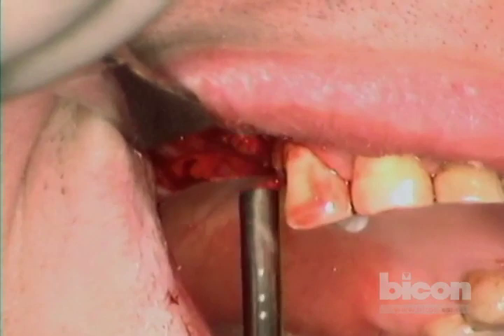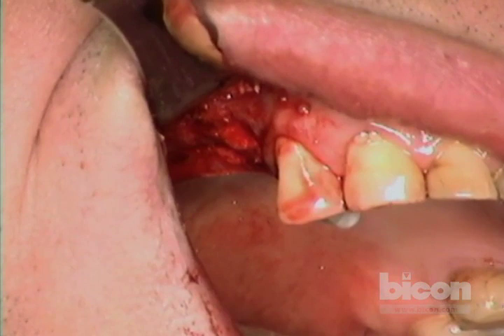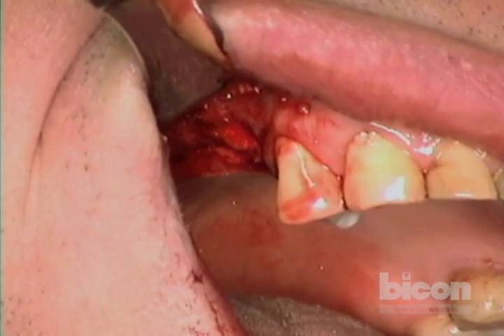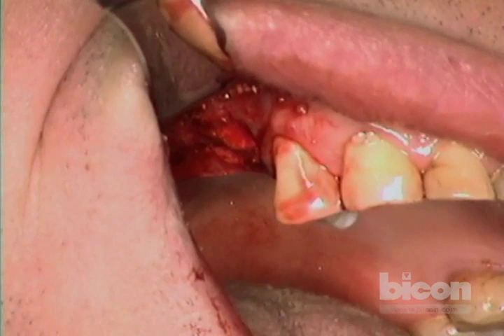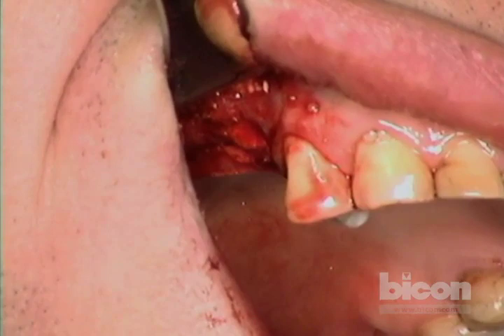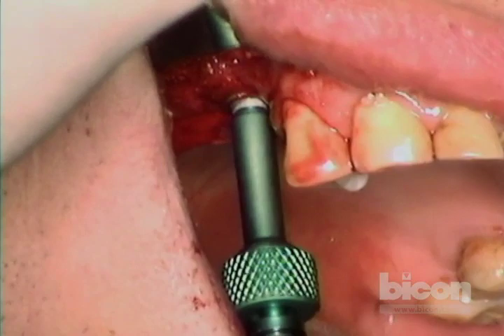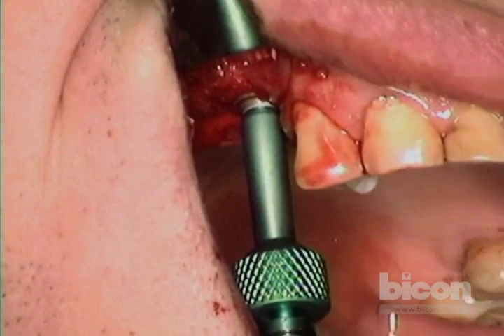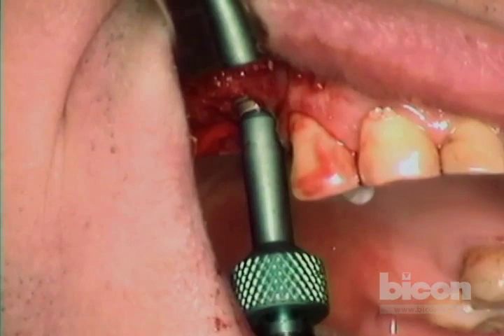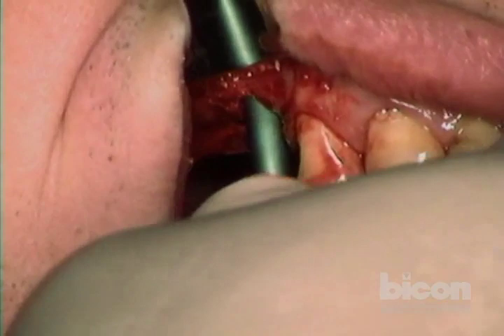I've put quite a bit in there — now I'll place the implant using an inserter-retriever, which is the most predictable and easiest way. The implant is placed on the inserter-retriever, and initially I'll thread it in just by twisting and pushing. This gentle twisting and pushing can be very effective; however, the final seating will be gentler if done with slight tapping using a surgical mallet.